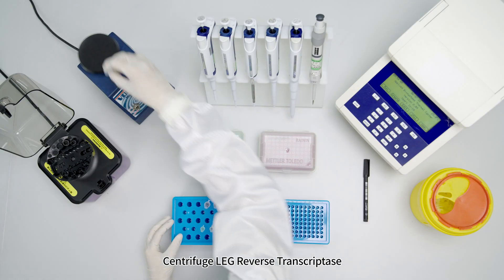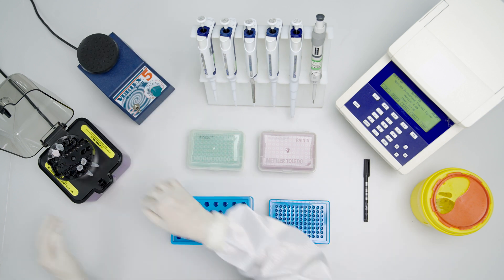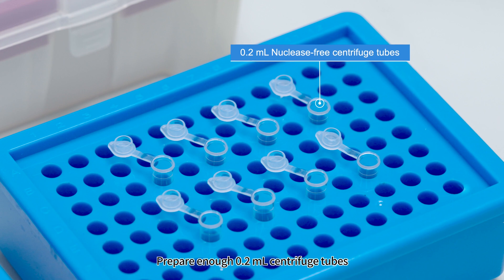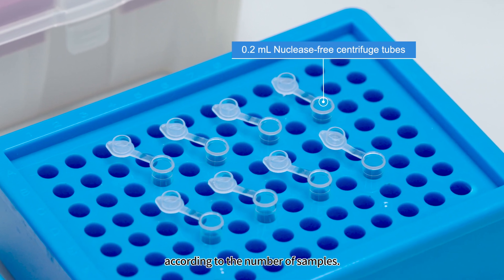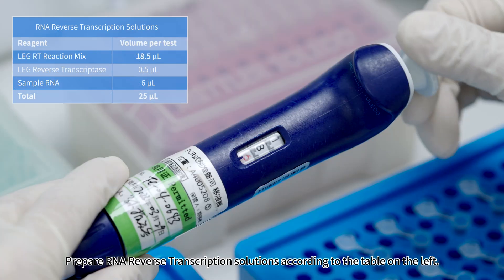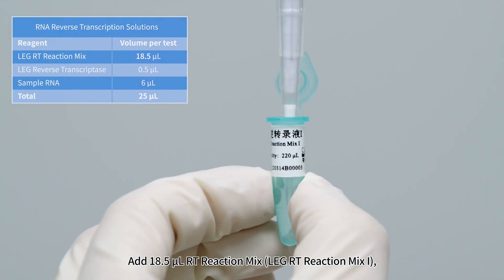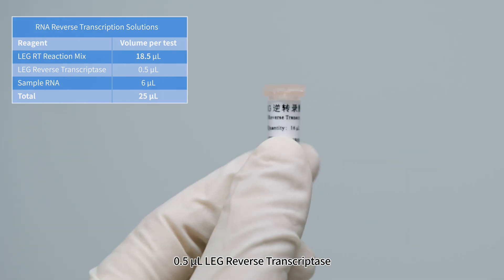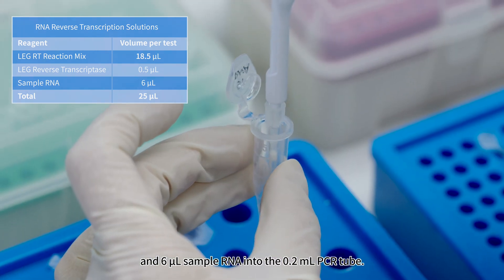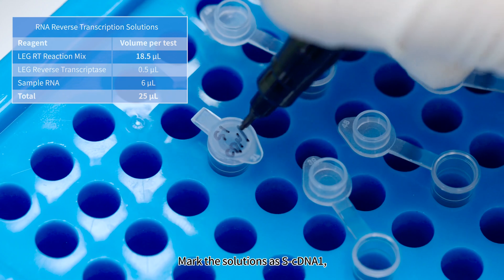Centrifuge LEG Reverse Transcriptase for 5 to 10 seconds prior to use. Prepare enough 0.2-milliliter centrifuge tubes according to the number of samples. Prepare RNA Reverse Transcriptase solutions: add 18.5 microliters LEG-RT Reaction Mix 1, 0.5 microliters LEG Reverse Transcriptase, and 6 microliters sample RNA into a 0.2-milliliter PCR tube. Mark this solution as SCDNA 1.